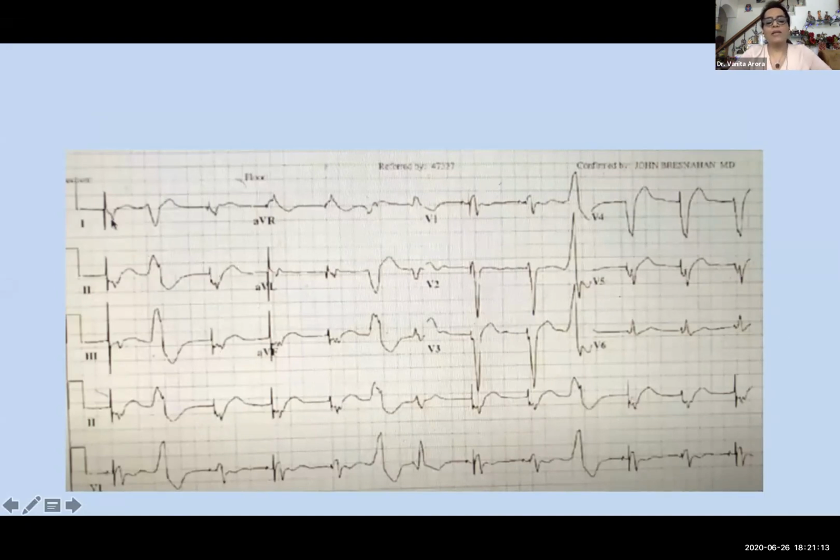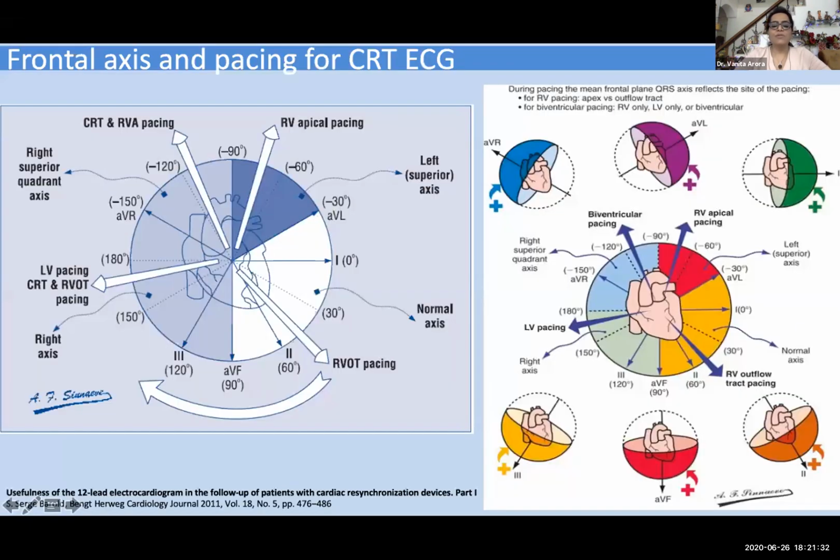This will not let the biventricular pacing reach more than 95%, which is what we are aiming at. So it is better to take care of these ectopics, do an RFA, and just get rid of these ectopics, or stabilize the medical therapy, which is very important to give a good result in these patients.